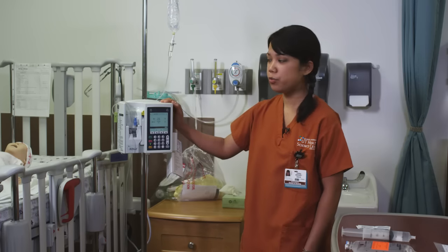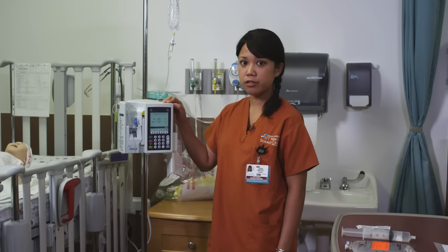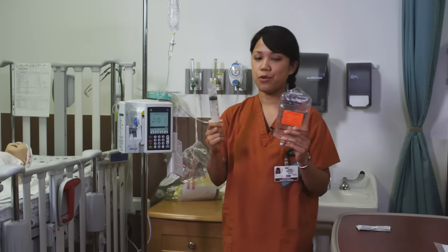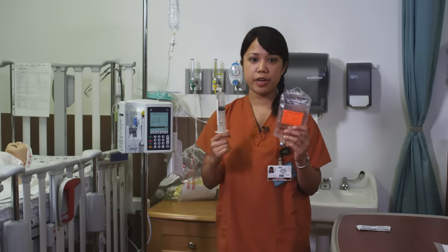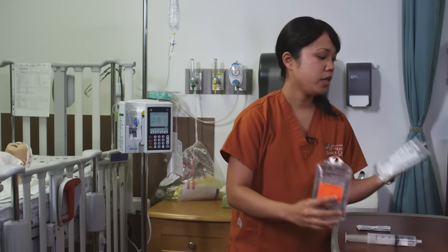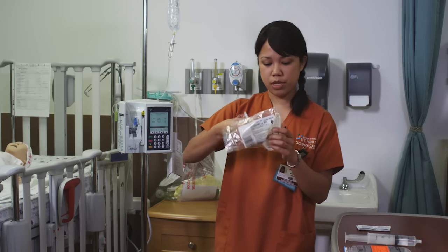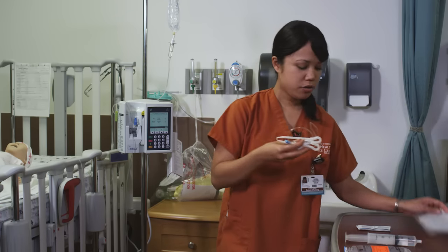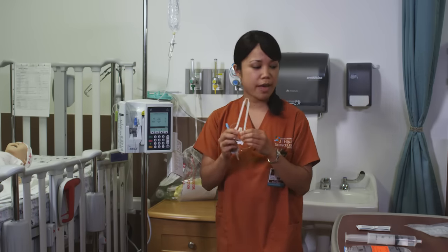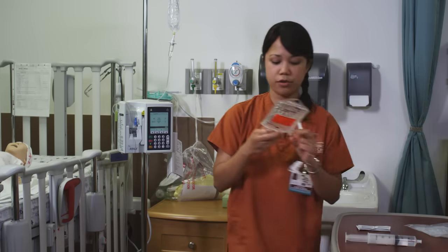Our pump has two channels. Usually the first one is used for primary IV fluids, and the second channel is usually for medications, which come in either a bag or a syringe. Your syringe comes from the pharmacy ready to go, but your bag needs to be primed. You'll need a piggyback IV — it says secondary IV set. You'll also see this hanger; with the plum pump you can use it or not. We're not going to use that for now. So you're ready to prime your tubing.